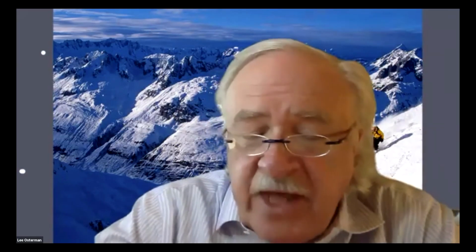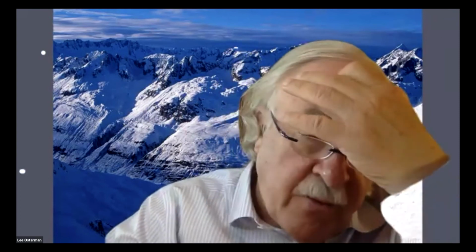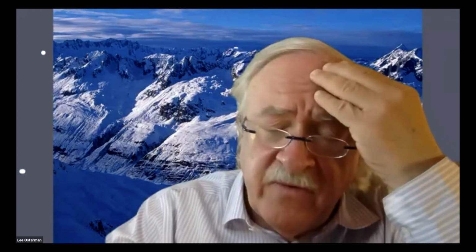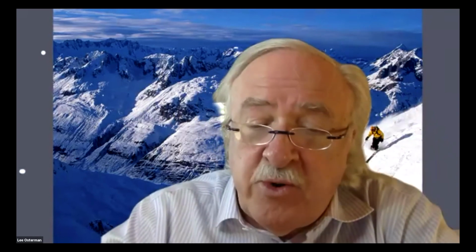I don't use any advanced imaging in most arthroscopic cases. I would add that if you look at the literature, while wrist arthroscopy has low complication rates, some of the extensor tendon injuries which have been reported either as case studies or having been referred personally are in recurrent ganglions, because the tendons get somewhat displaced and irritate your portals. So I would say that's it.